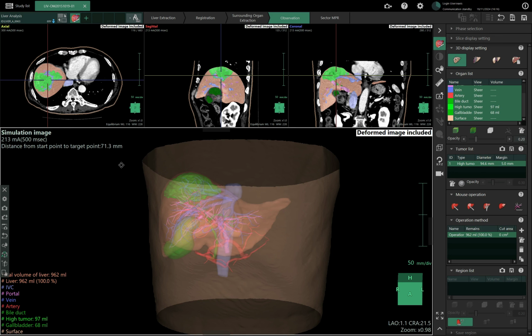This is a concern that has been shown to me by some doctors. For example, there is a hospital here in Madrid, Puerta de Hierro, that has concerns about the result of the segmentation extractions we are doing here.